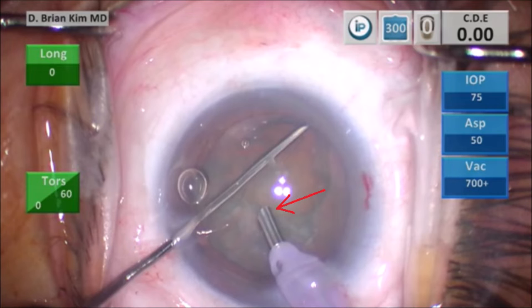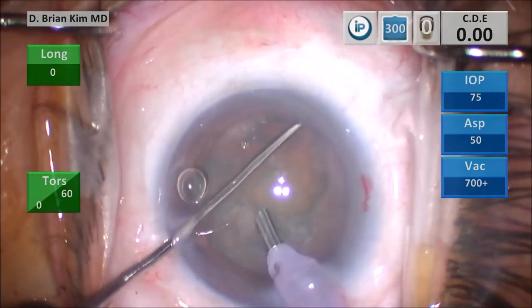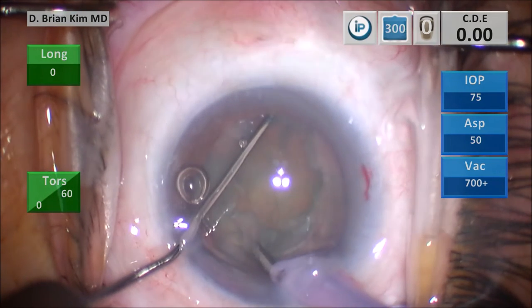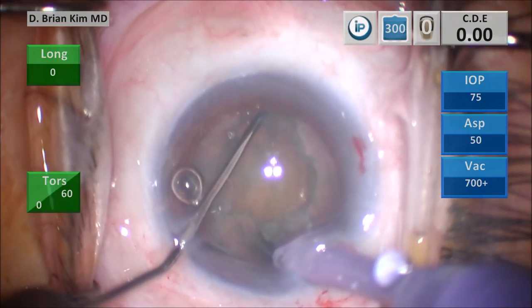Most horizontal chopping surgeons are familiar with the chop movement from this point forward. You place the chopper out to the equator and pull centrally — that's the horizontal chop maneuver. Now, the phaco tip is going to be tilted vertically, and I'm going to stab the surface of the lens. As I'm pushing with the chopper centrally, the counterforce is the phaco tip, and because I'm holding the lens with the chopper on the other side, I'm going to use the phaco tip to bury into the lens material and then start pushing it. This causes a fulcrum point where I'm actually catching and holding the lens, and I'm able to cut through and crush through the lens because of the two opposing forces of the chopper and the phaco tip.